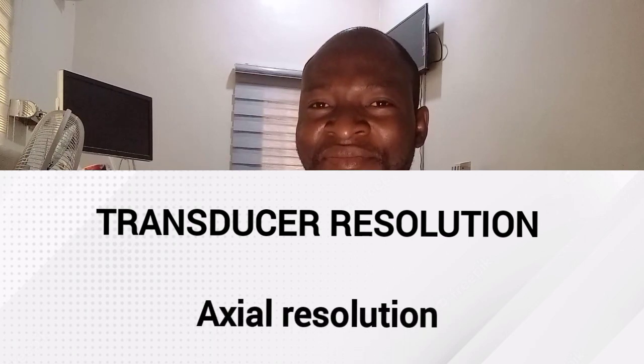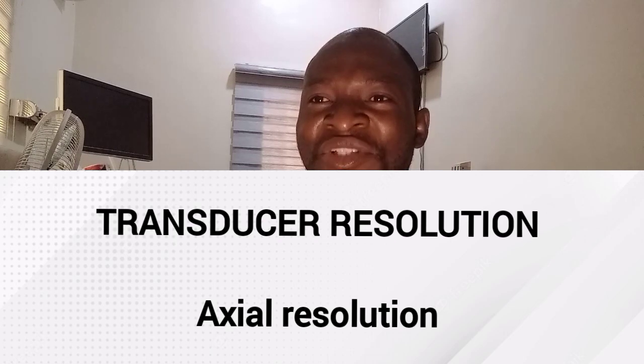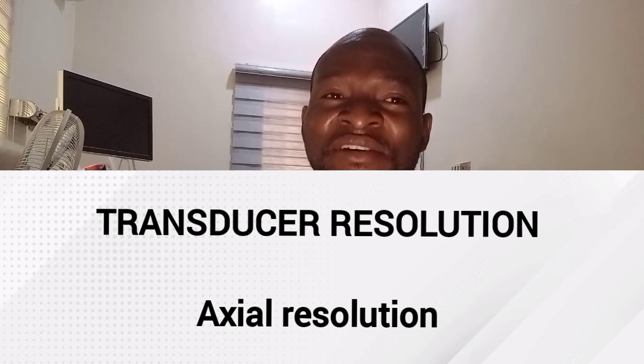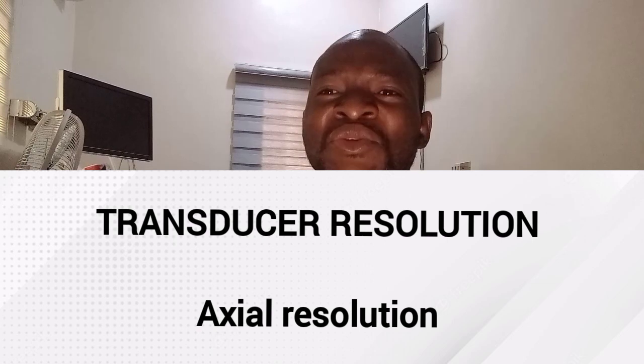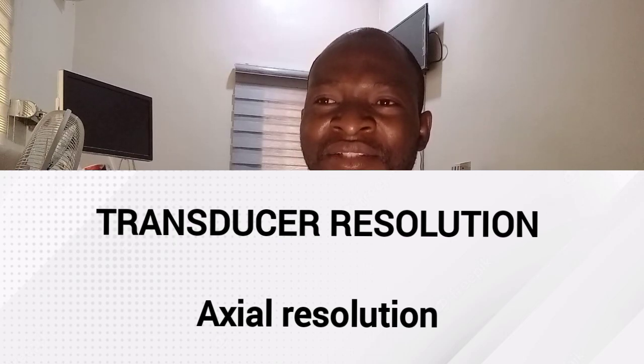Axial resolution is dependent on spatial pulse length, which is directly dependent on transducer frequency. A good clinical example of the impact of satisfactory and unsatisfactory axial resolution is the display of the normal pancreatic duct.